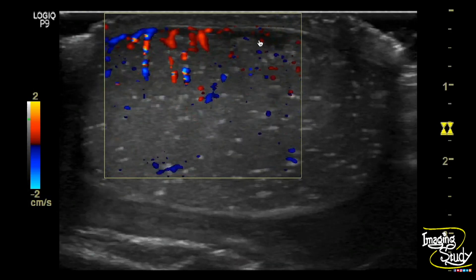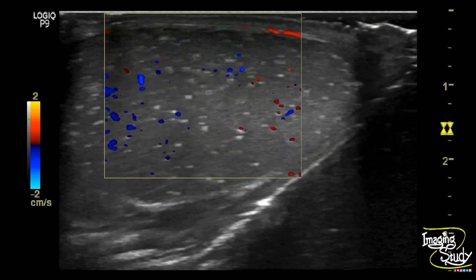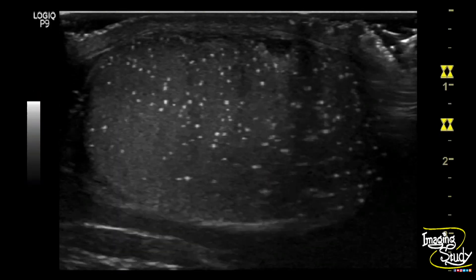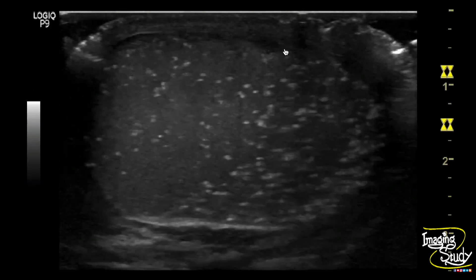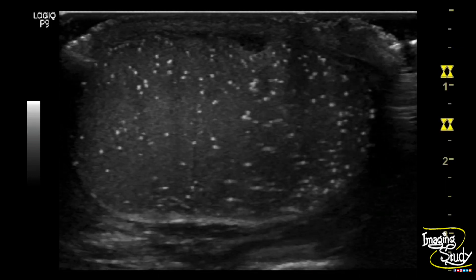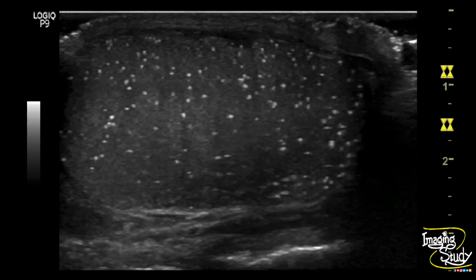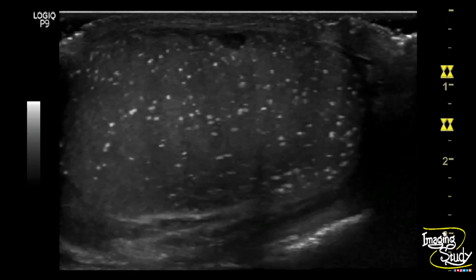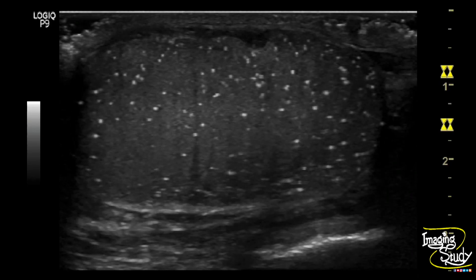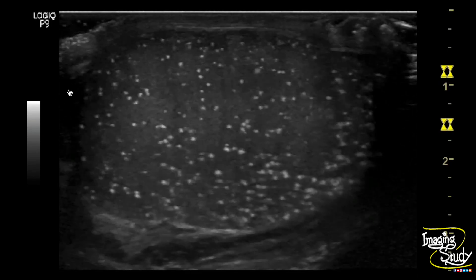On color Doppler, you can see increased vascularity at the anterior part of the testis adjacent to that irregularity, indicating a localized inflammatory reaction. So this irregularity is due to the hematoma at this point.